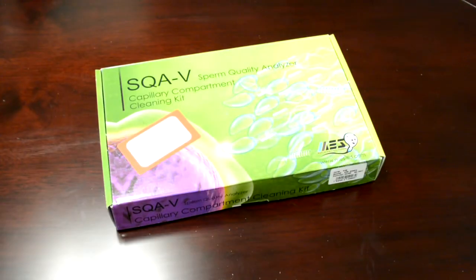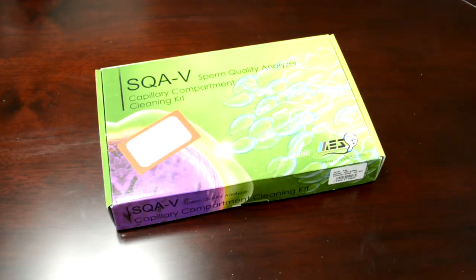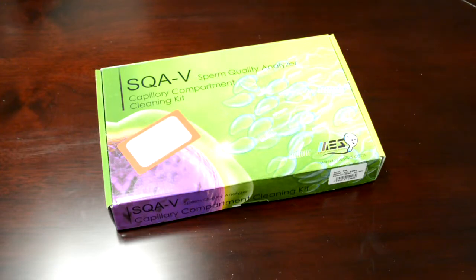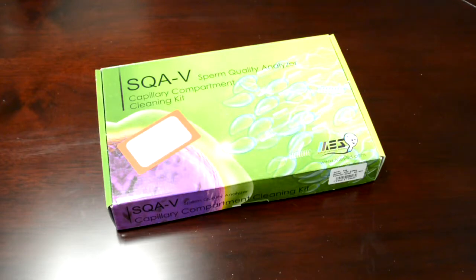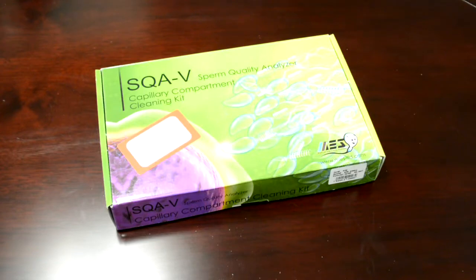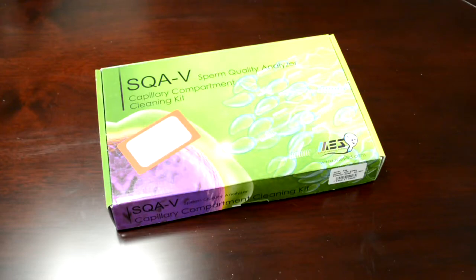Proper cleaning of the SQAV is extremely important to keep the instrument accurate and reliable. For additional questions, please visit the website at www.mes-global.com or drop us an email service at mes-llc.com. And remember, it all started with a sperm.